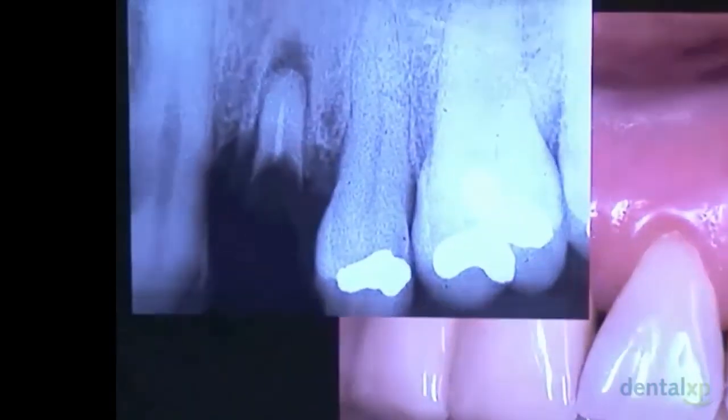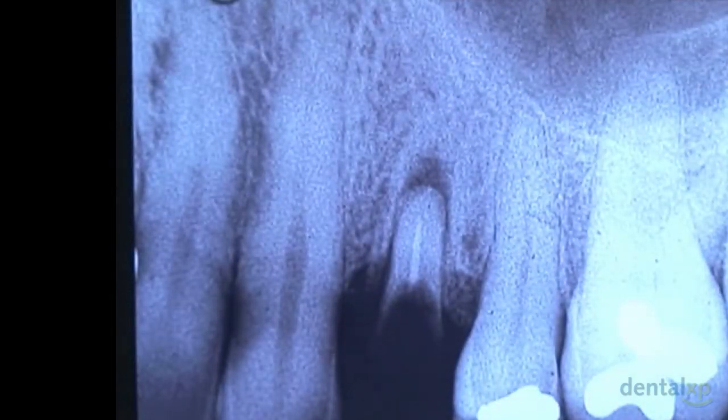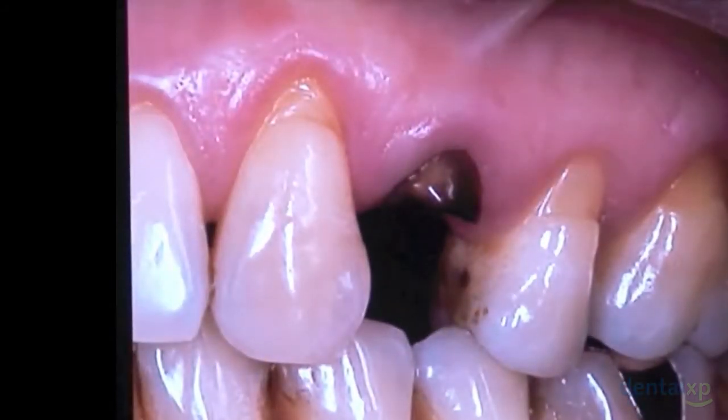Do we first treat the periapical issue? Do we do the extraction and immediate implant placement, or do we do a delayed procedure? Do we install an immediate provisional? Do we leave the site like this one? Do we install the implant and an immediate provisional? Those are the questions that I will answer in the next 15 minutes.